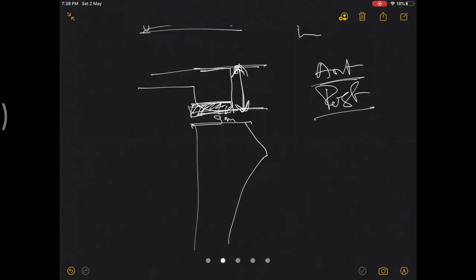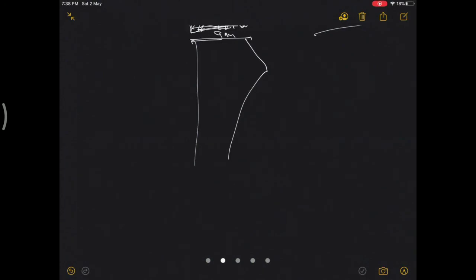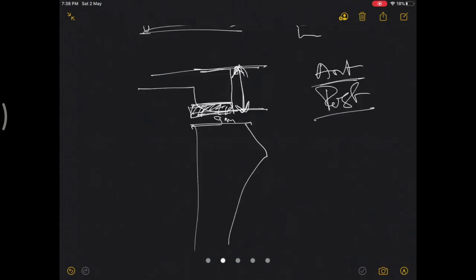So before that, does the 9 mm depend on the size and thickness of the implant, right? Yes, this 9 mm is the thickness of the implant. It varies according to the company. Mostly it is 9 mm, but it varies according to the implants, but most of them will usually have a 9 mm. There is some uniformity kind of a thing.